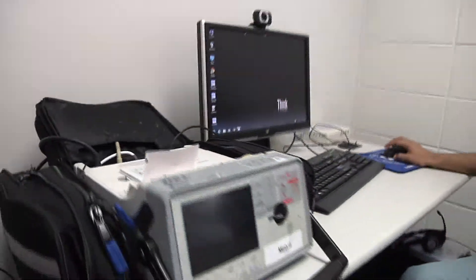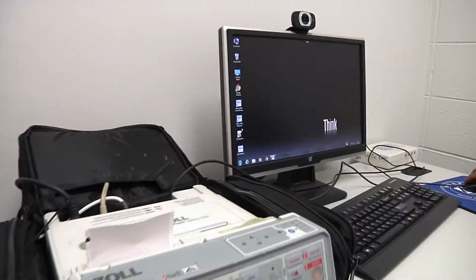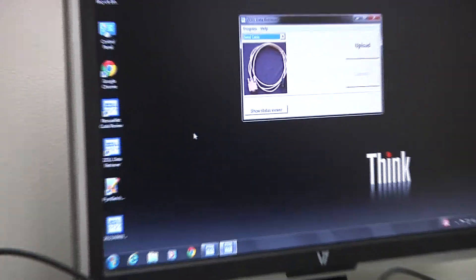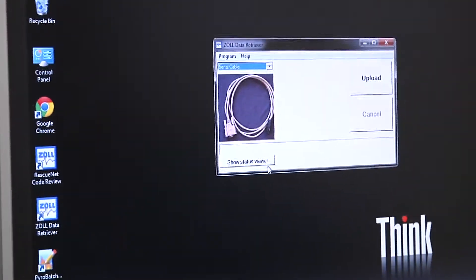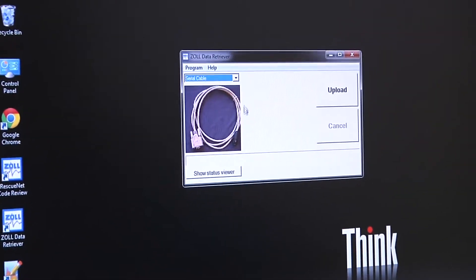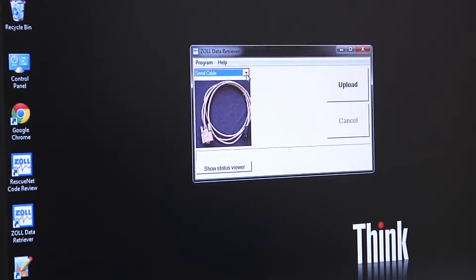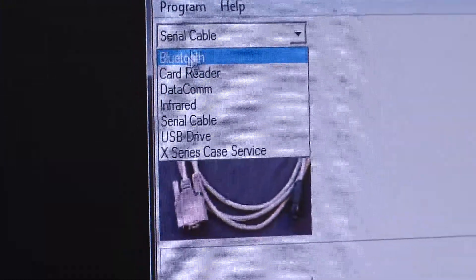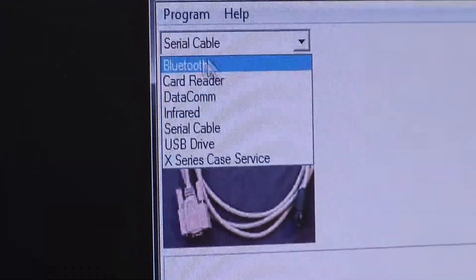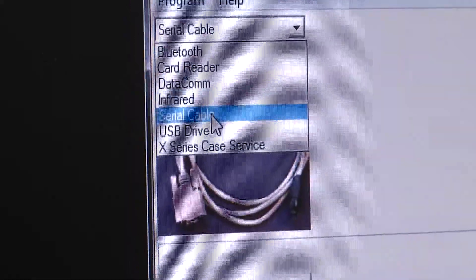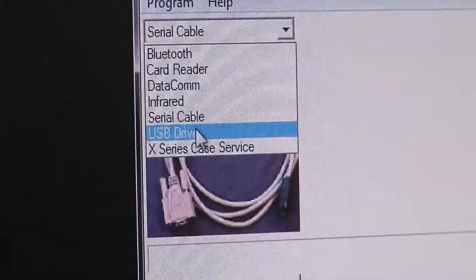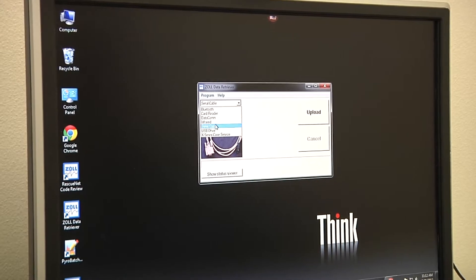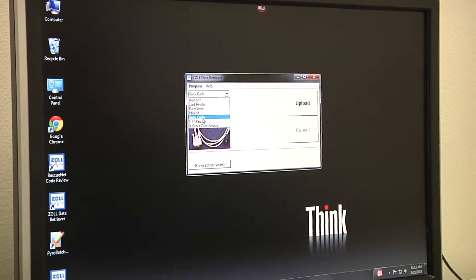Then I'm going to come over to the Zoll data retriever icon on the desktop, which should be located on your computer, and pull that up. Make sure that the serial cable option is selected. There are a number of routes for this card to be transmitted, and we're using the RS-232 cable, so we want to select serial cable.